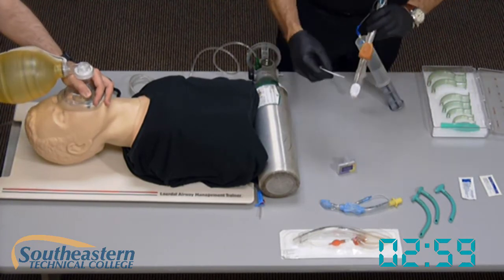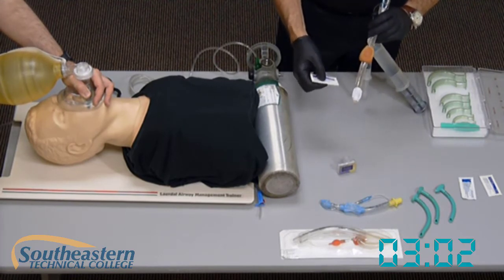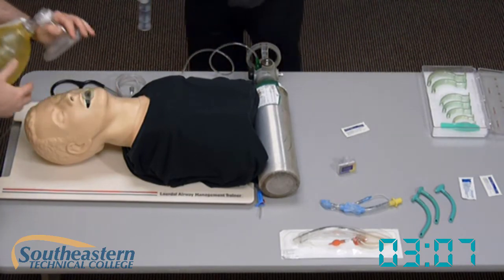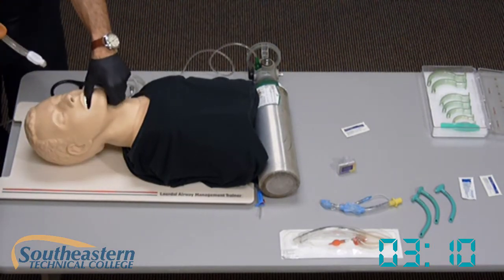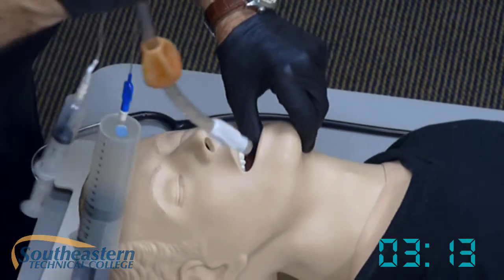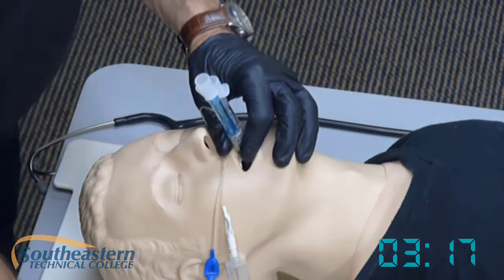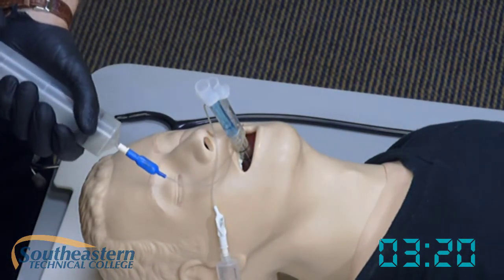I'll verbalize lubricating the distal end of my tube with KY jelly or any water-based lubricant. As I get ready to insert the combitube, my instructor will remove the oropharyngeal airway and stop ventilations. I will insert the combitube until the black line is at the level of the teeth.